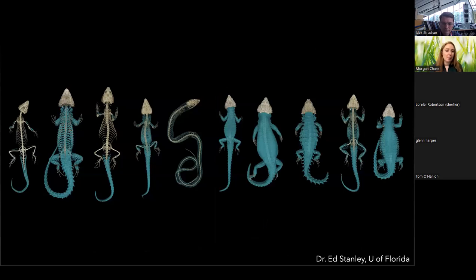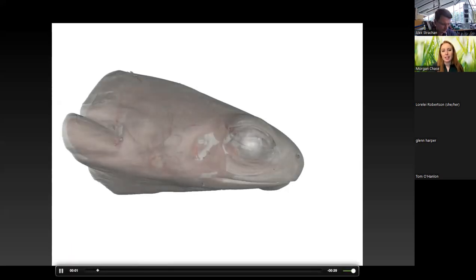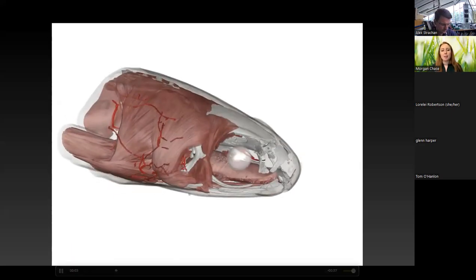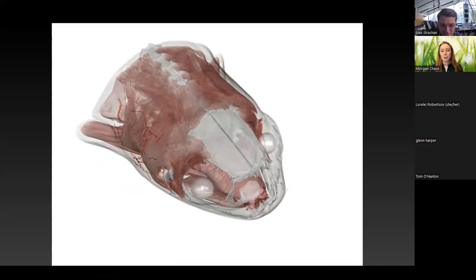more examples of the varied kinds of armor that these would have, and these are all related, but adaptation is a crazy thing, right? And so, to do the bony parts of this animal is one thing, but to get soft tissue is entirely another. And so this was another scan that was done. And so he even appropriately colored all of the tissues. So I do apologize. It's a little gruesome.